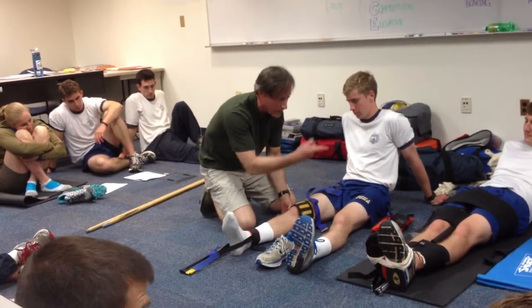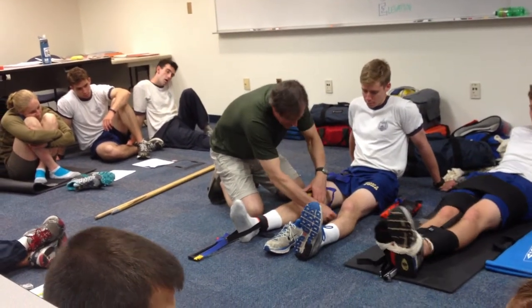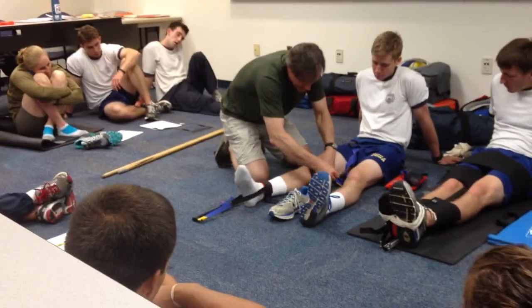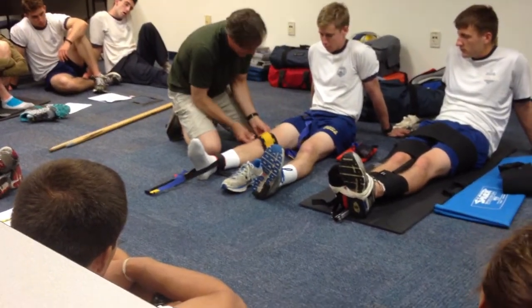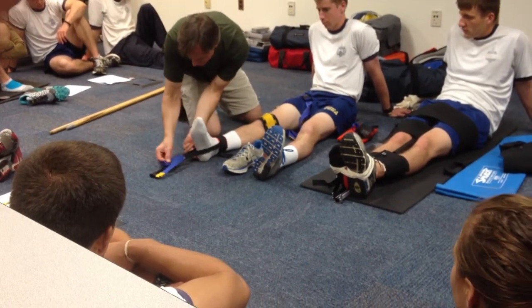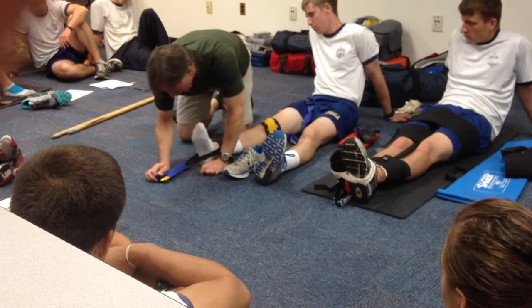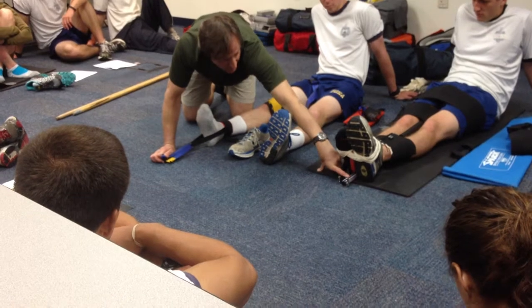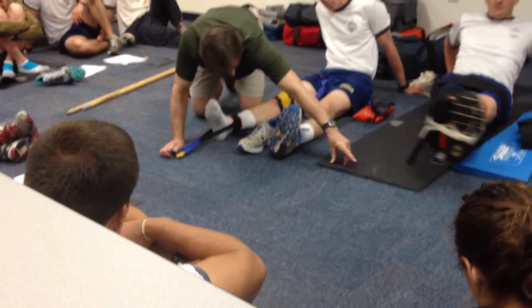The other ones we put the pads on after the mechanical traction replaced the manual traction. But this one, the goal is to put this one directly over the knee because it provides some stability here while you're pulling the traction. No more than 10-15 pounds or 10% of the patient's body weight. You can see the little scale here on the Sager.